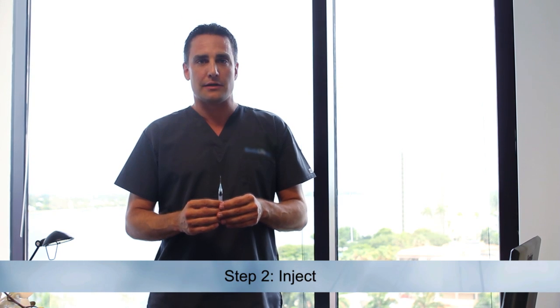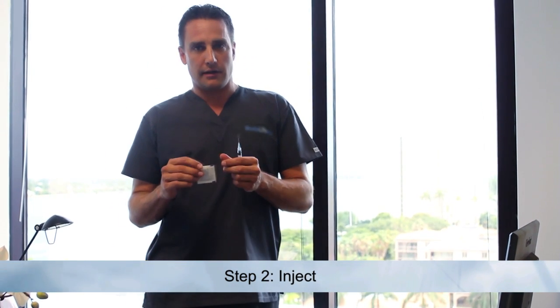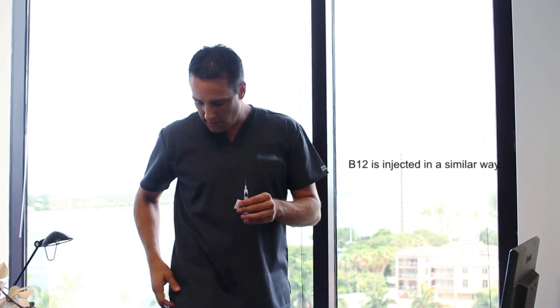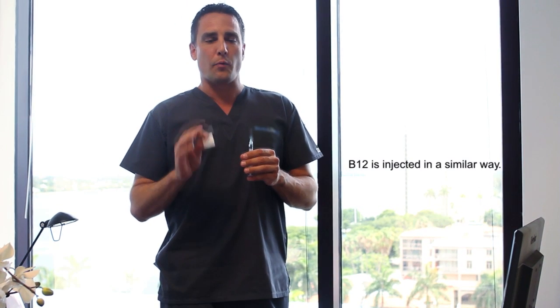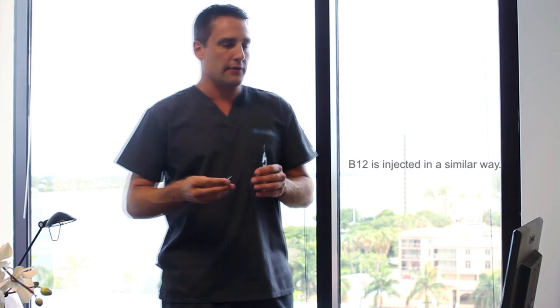I'm going to demonstrate how to do a testosterone cypionate injection. The first thing you want to do is, of course, be sterile. Take your alcohol swab and clean off the place where you're going to do the injection. The injection is done on the upper outer area of the buttocks. Before I clean the injection site, I want to explain where this is approximately done. There are two visuals I want to create that you can see on the diagram.